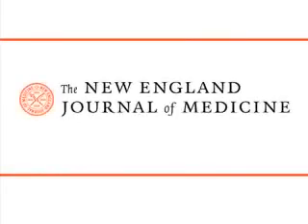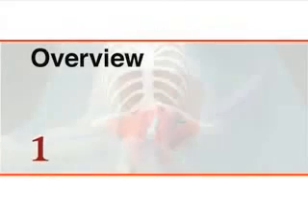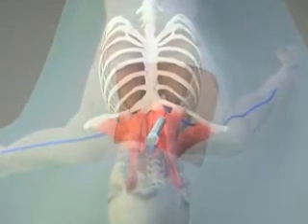This is a video in clinical medicine from the New England Journal of Medicine. The placement of a central venous line is an essential technique in the treatment of many hospitalized patients.